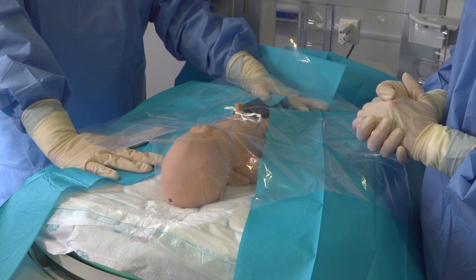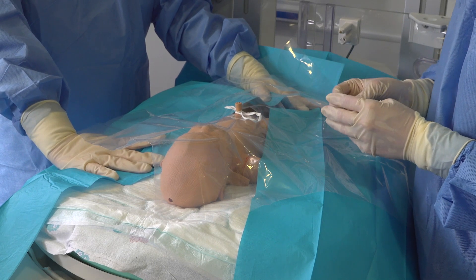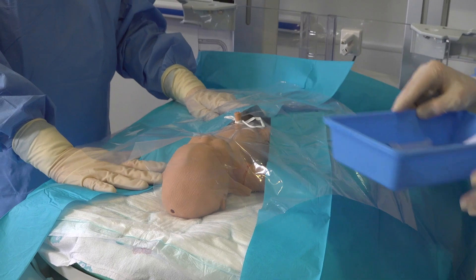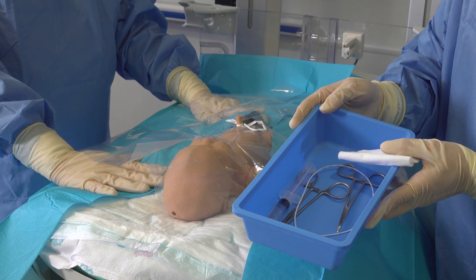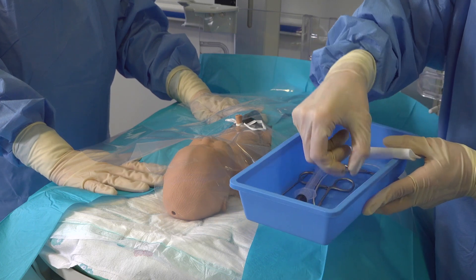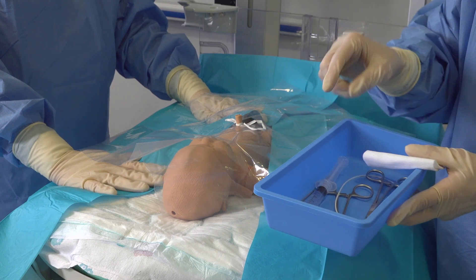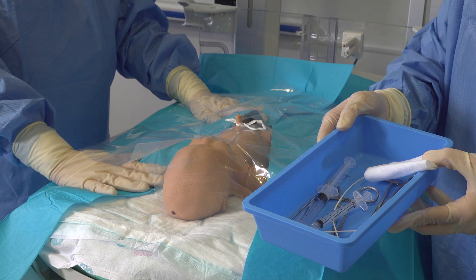We generally always insert our UAC first of all because the arteries constrict and hold it in place prior to inserting our UVC. For our UAC insertion I use the box to collect the equipment that you need to insert it. In this we have our dilator, our devices to hold our cord in place, our UAC itself and a flush to ensure it's in correct position. You can also take an additional sterile syringe for any additional blood sampling you need to do at this point.